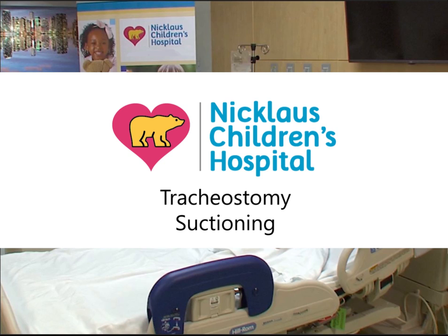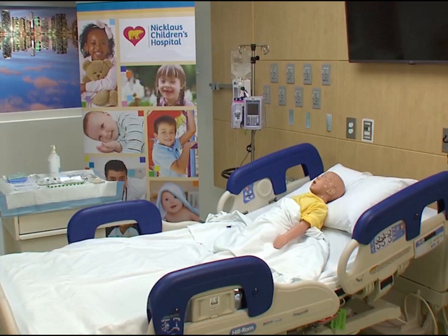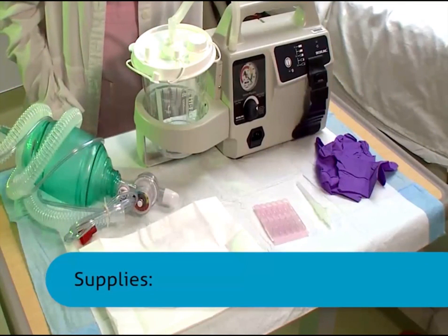Knowing the proper way to suction your child's tracheostomy is important for their health. Before you begin, gather all the supplies that you will need. All equipment and supplies must be at the patient's bedside before you begin suctioning the child's tracheostomy.